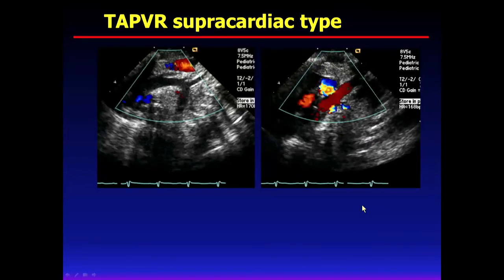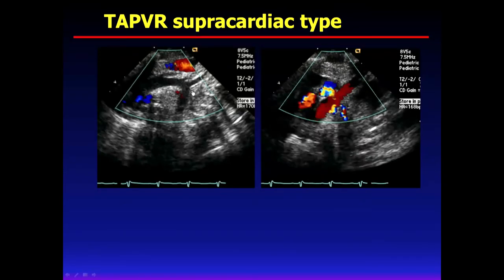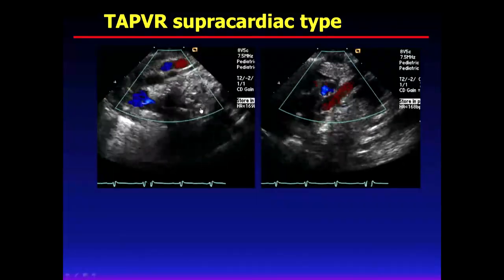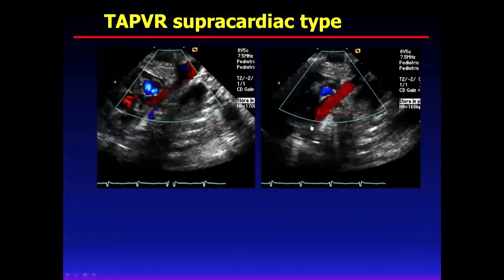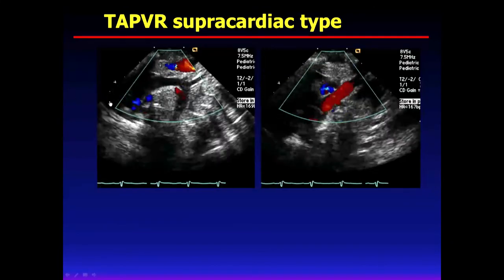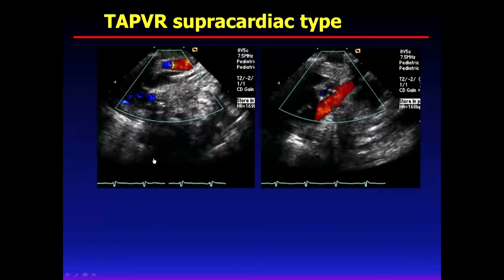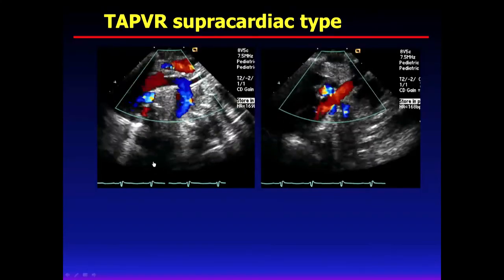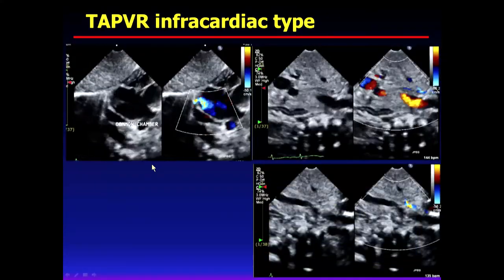And then this time, pulmonary venous anomaly. This is a supracardiac type TAPVR. We can notice here the venous flow goes up, surrounding the aorta, and then goes into the, so this is an ascending vein, we call that anomalous return.